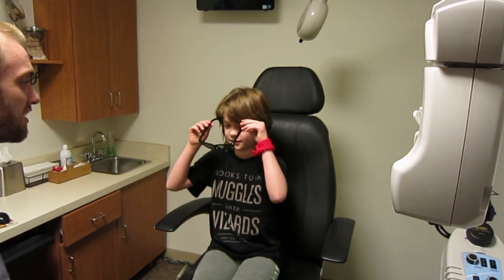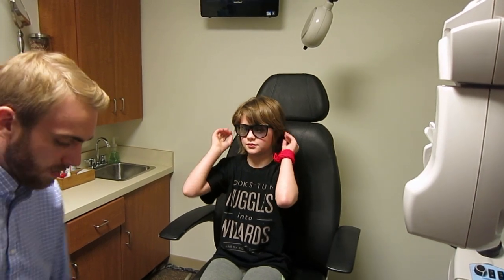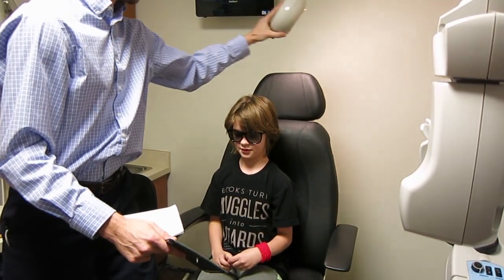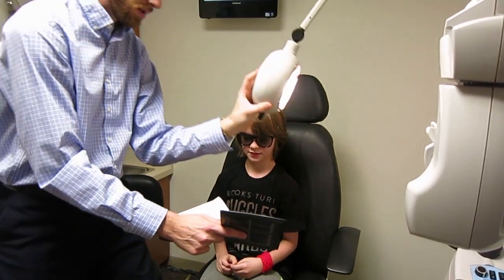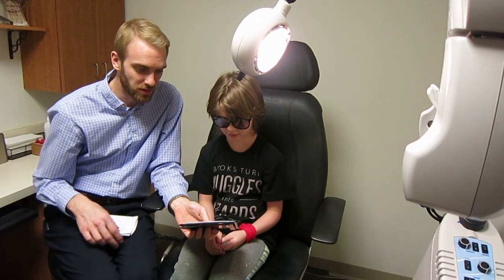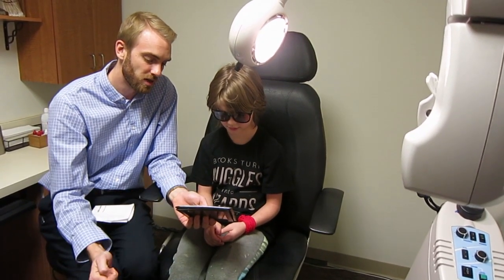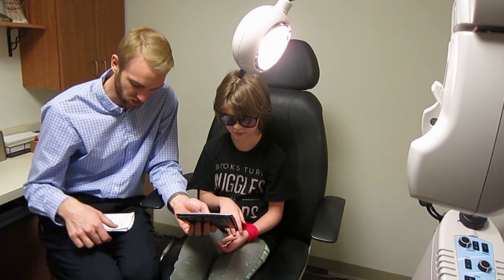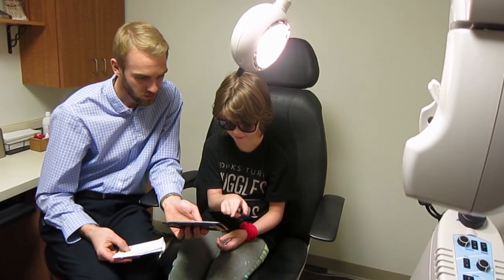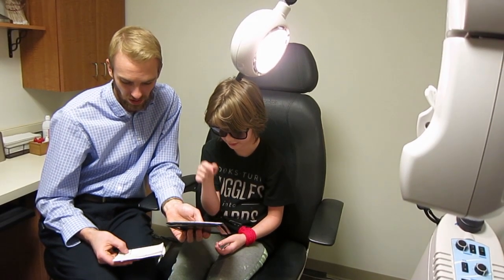I'm going to put these 3D glasses on now — I'm going to check your depth perception. You see the 3 dots there? You're going to start by just pushing on each one that's sticking out of the page. There's that one — that one — I think it's that one, it's a little bit less out. I think that one there. You're flying!